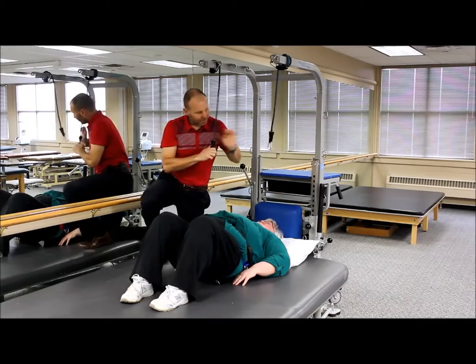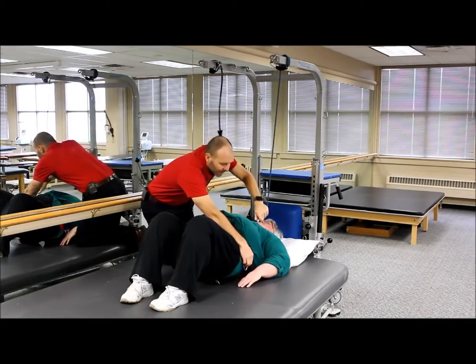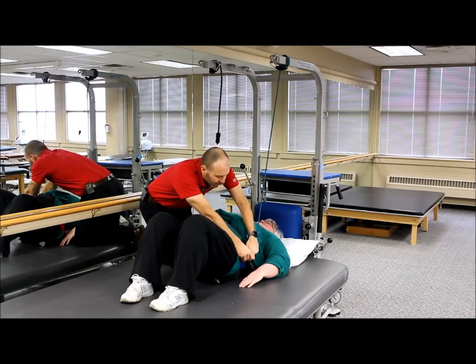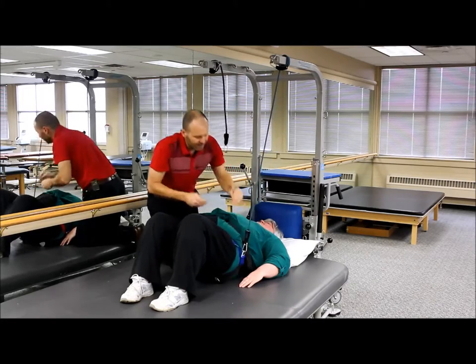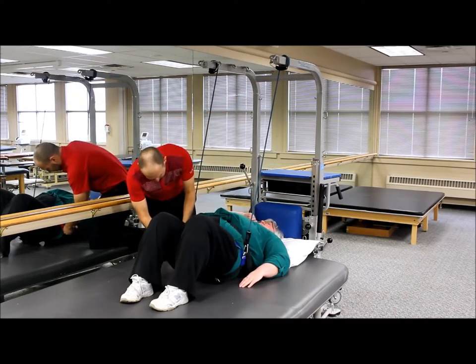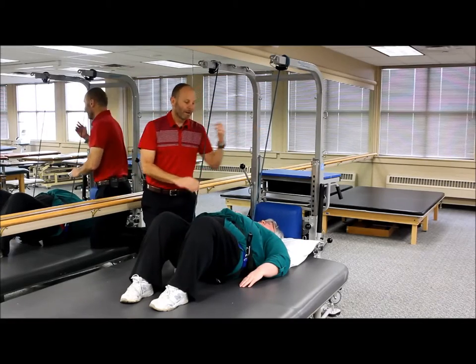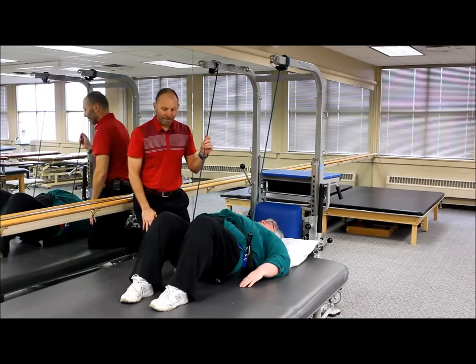We're going to attach this to our support harness — the standing support harness that we can also use for sit-to-stands and our standing frame. This is an additional accessory. Now we're giving some amount of support that's going to help them with that bridging maneuver.